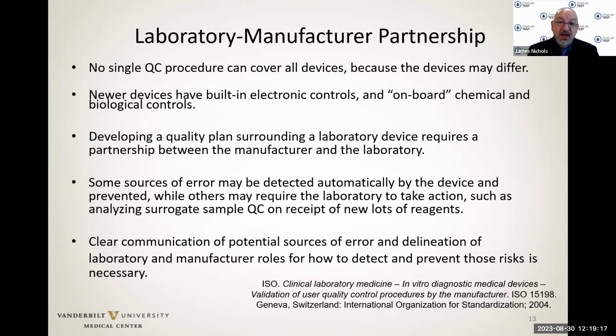Some sources of error may be detected automatically by the device and prevented, while others require the laboratory to take some kind of an action, such as analyzing liquid quality control when you receive a new lot of reagents, because we don't know how those reagents were shipped and what environmental extreme temperatures, conditions they may have been exposed to during transit. So it's always a good step to test quality control when they come in to make sure that they are actually viable before we put them on the shelf and start using those reagents for patient testing.